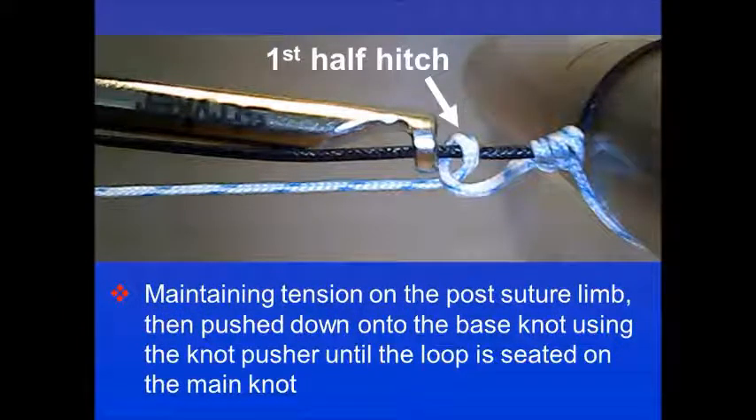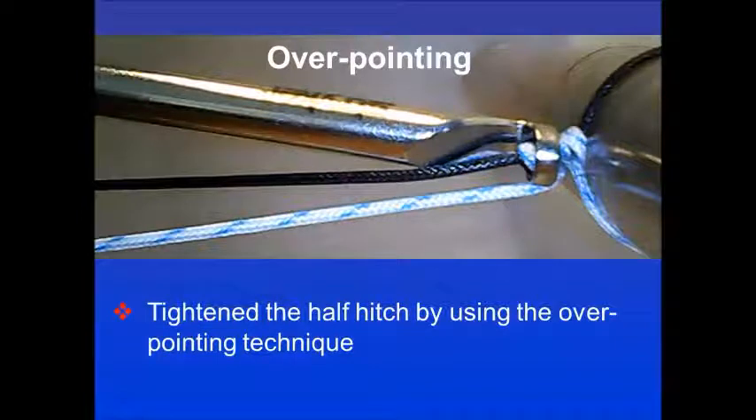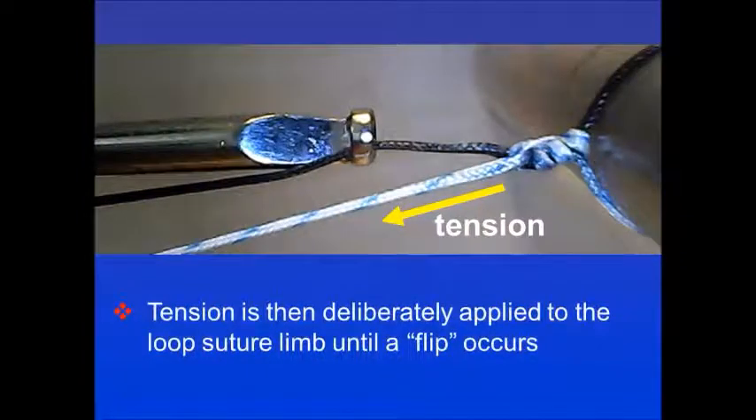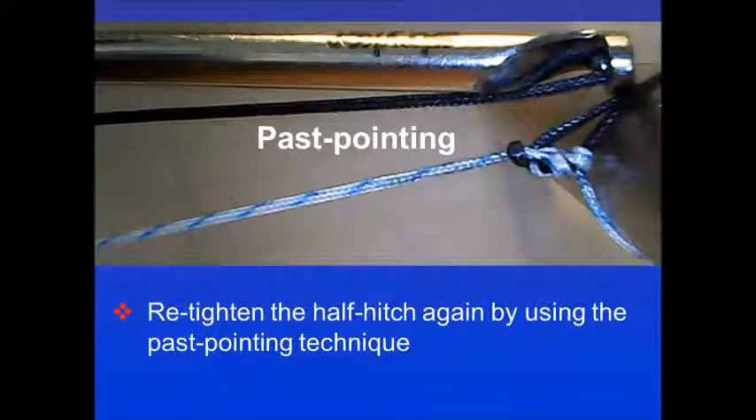Maintaining tension on the post suture limb is important throughout this tie. Overpointing is then done to tighten the half hitch using the overpointing technique. Tension is then deliberately applied to the loop suture limb until a flip occurs. Re-tighten the half hitch again by using the past-pointing technique.